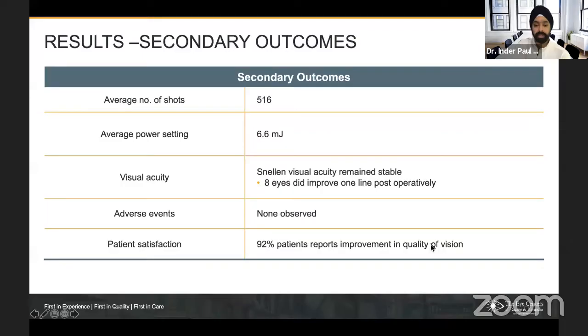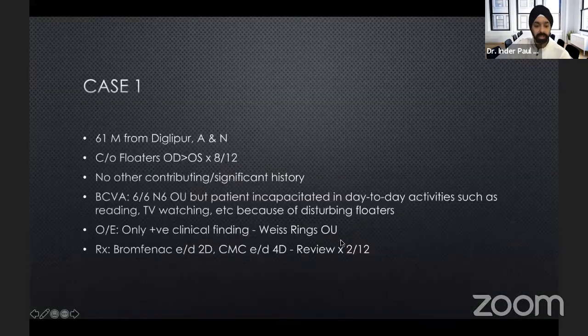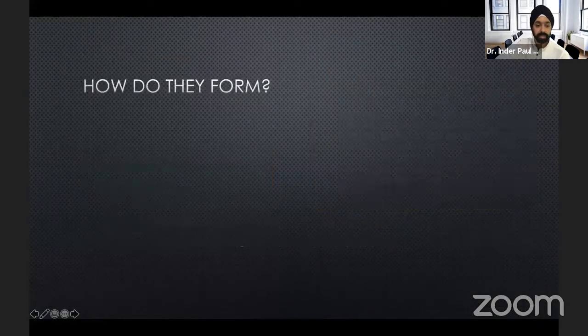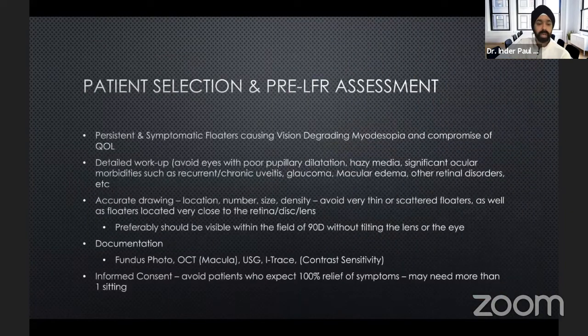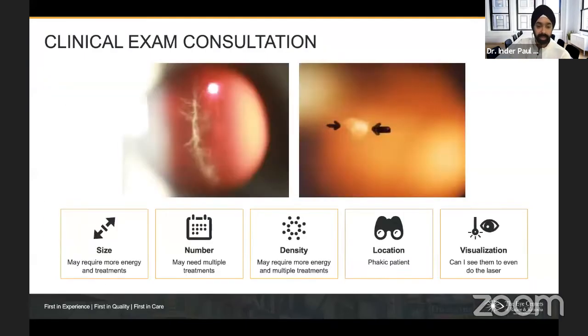But yes, those are great questions that people have asked about in terms of where do we start? So I'm just going to fast forward through Dr. Biswas's presentation here. And so what I would do is, first of all, pick the right patient.